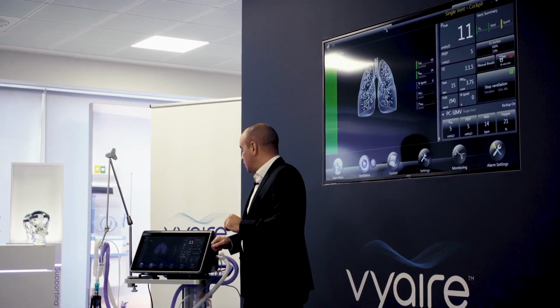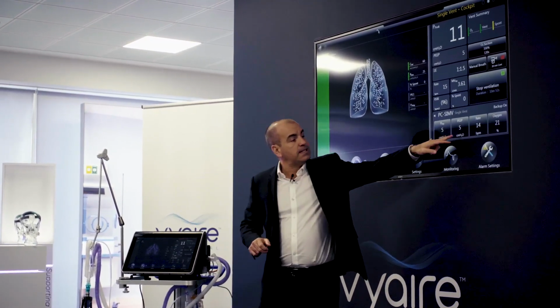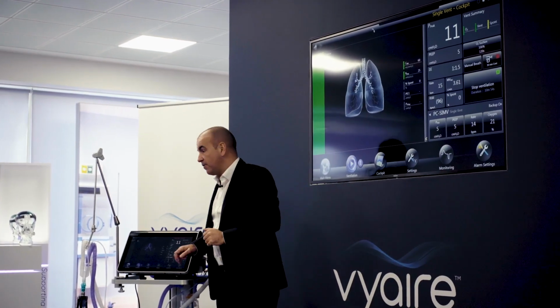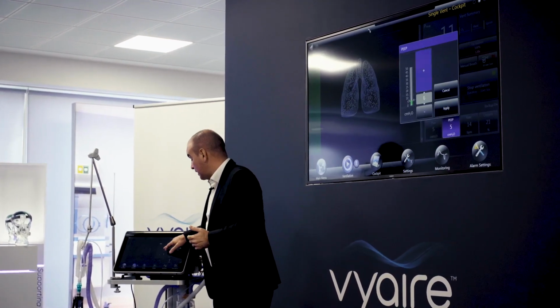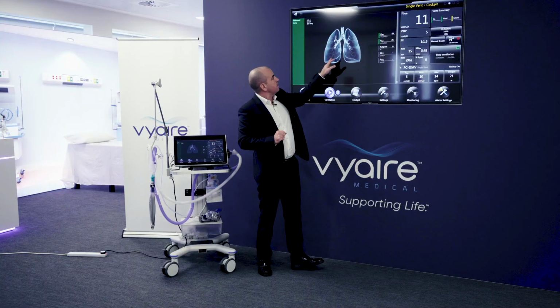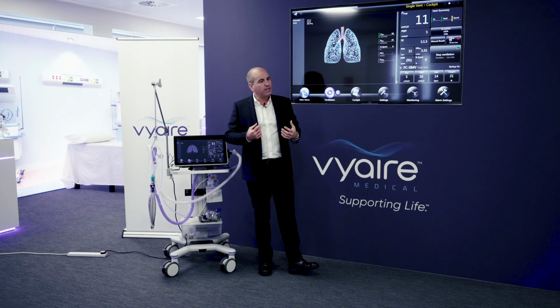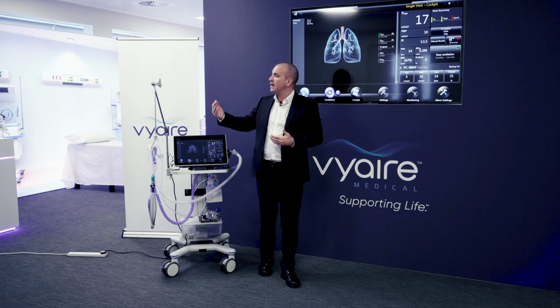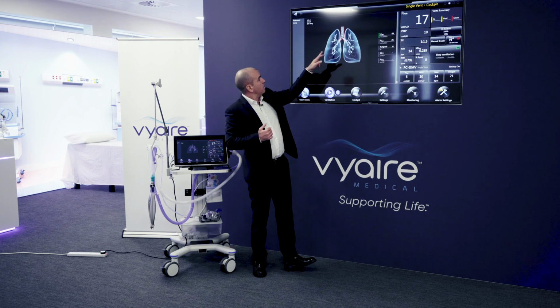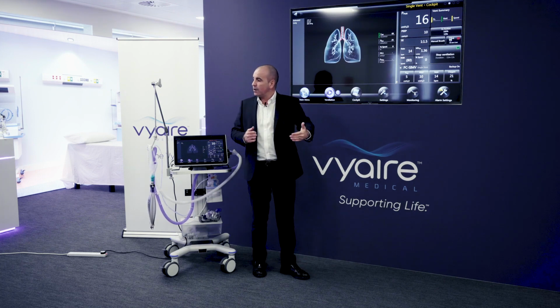Whilst we're waiting for that to change, you can also see here that with this setting, with the PEEP at 5, if we increase that, maybe with a sicker patient, for instance, you see that essentially the more bubbles remain in the lung. And that, again, that's a visual indicator that you might be using moderate to maybe higher levels of PEEP. So it's averaged over here, like I say, it's assessing breath by breath, but averages over 8.